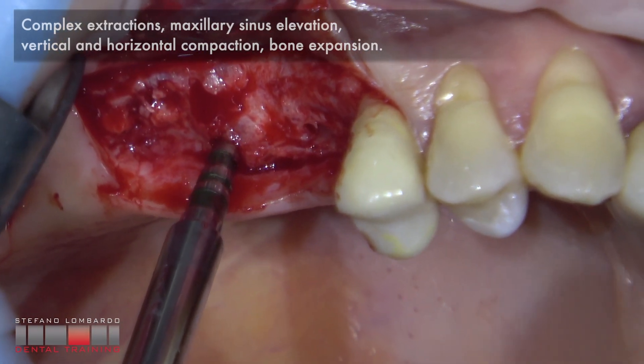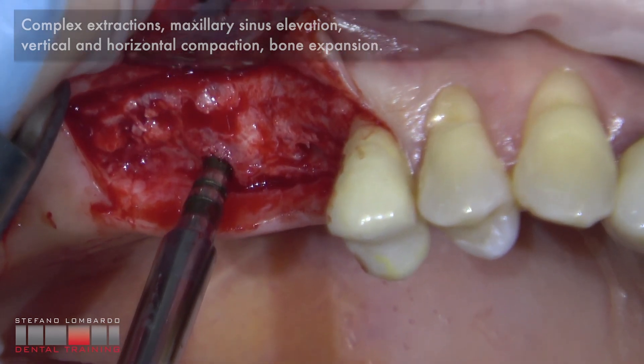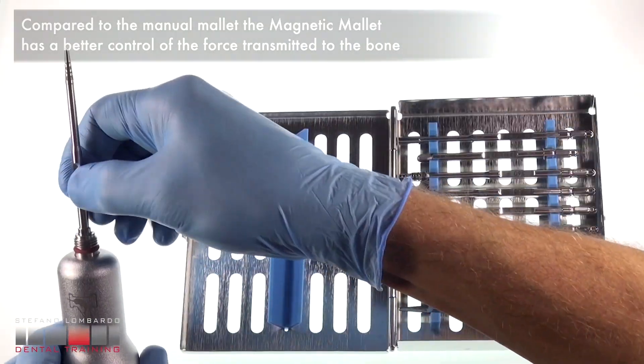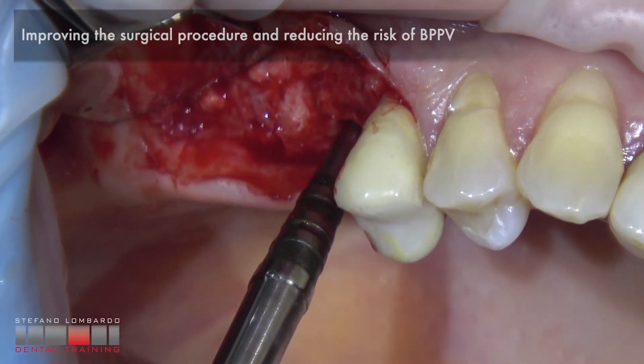Applications include complex extractions, maxillary sinus elevation, vertical and horizontal compaction, and bone expansion. Compared to the manual mallet, the magnetic mallet has better control of the force transmitted to the bone, improving surgical procedures and reducing the risk of BPPV.